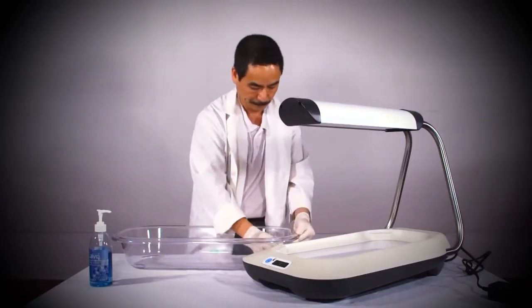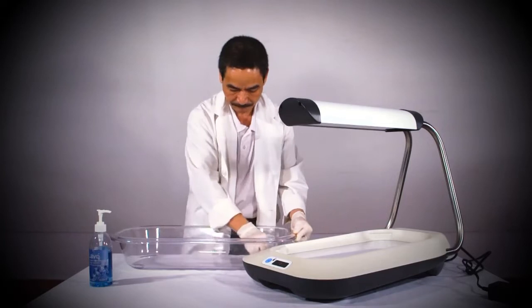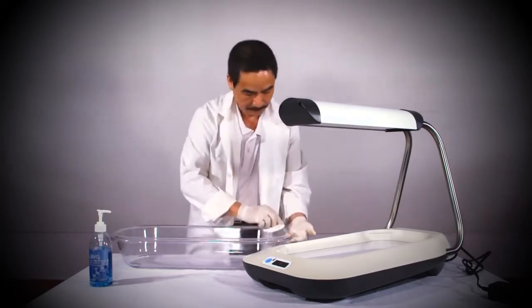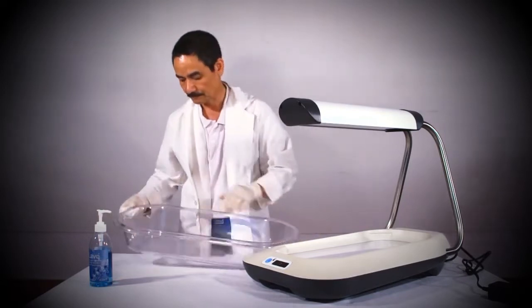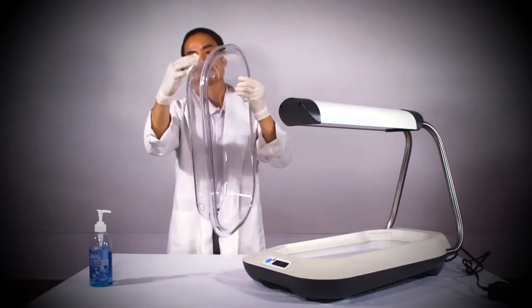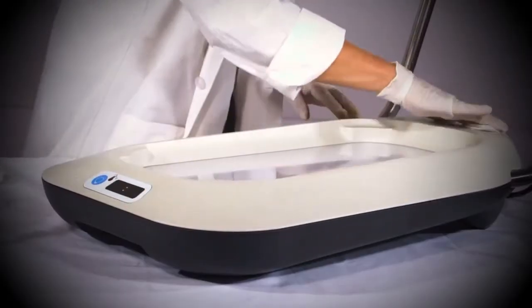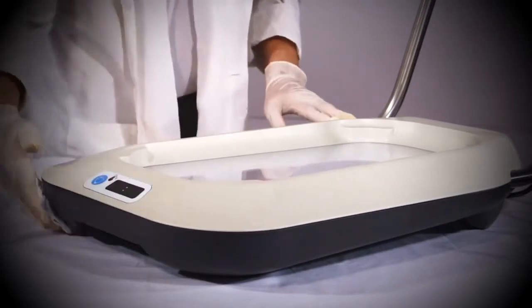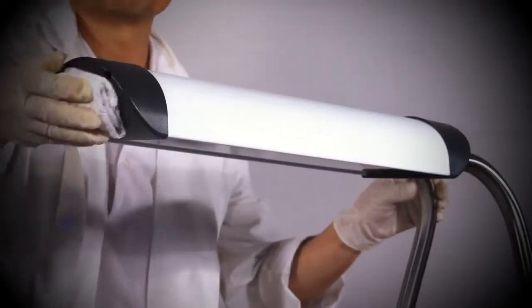Once you have plugged the cord into the electrical outlet, the only remaining step before using the unit is to clean the bassinet and the main unit. This must be done before and after use by each baby. To do this, first use a wet cloth to wipe down the unit and then use a disinfecting solution.